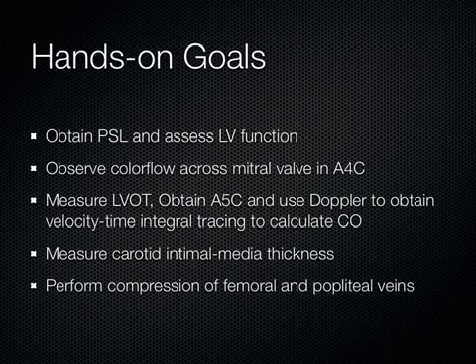Look at that carotid artery to where that intimal medial layer would be on a non-young person, and then finally get in the groin, get in the pop on your models, do some good compression ultrasound there, and do some augmentation, and watch how easy it is for those vessels to collapse.